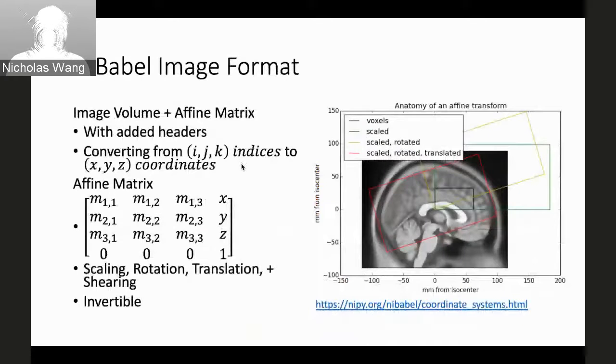And so what is Nibabel? Once Nibabel has taken in these files from either DICOM or NIFTI or however you're storing these image files, it treats them as an entire image volume plus an affine matrix in order to handle rotations, shearing, and changes to the image matrix. And this is important because DICOM generally treats images as a stack, and so they're aligned, but basically the XYZ coordinate frame is only up and down, and it can't handle any rotations and this sort of thing, which is fine when you're looking at a single image volume.